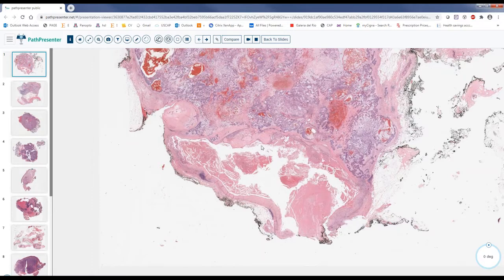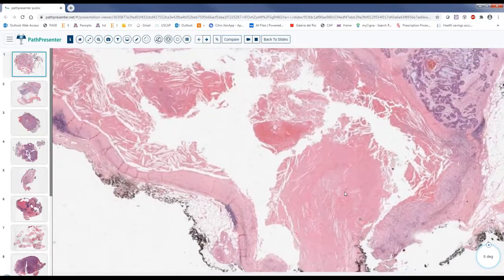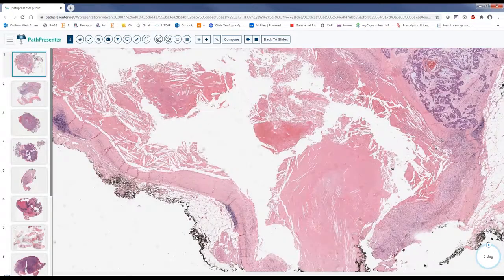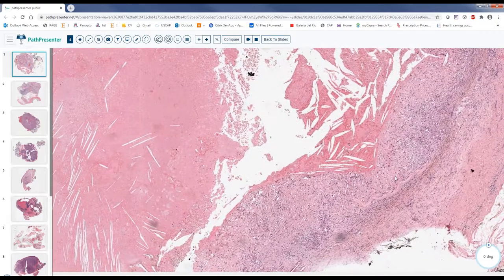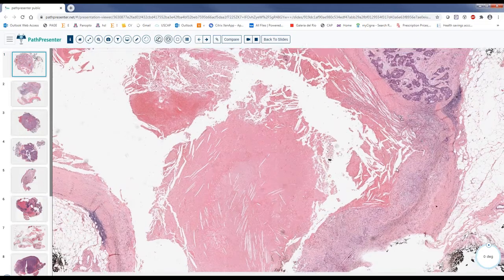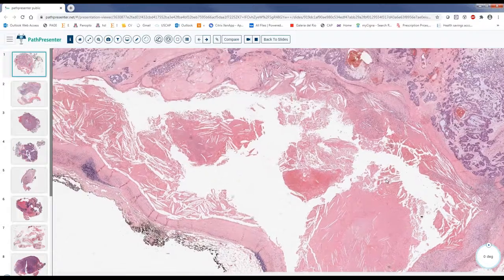It looks like a dilated duct. Yeah, so there is something which is not clear. There is some amorphous material in the duct, some granulation tissue here, maybe some granulomatous area, maybe there is hemosiderin-laden macrophages with chronic inflammation and fibrosis. There is a lymphoid aggregate. What do you think is going on? Why are we having these things here?